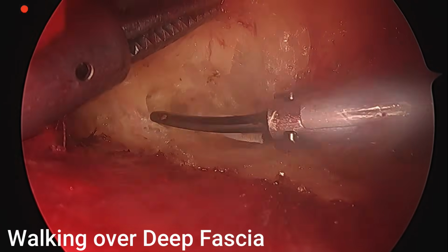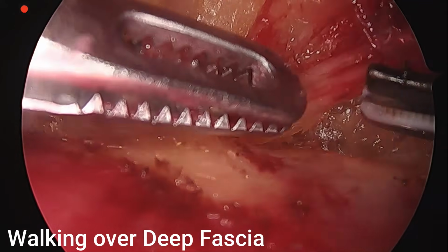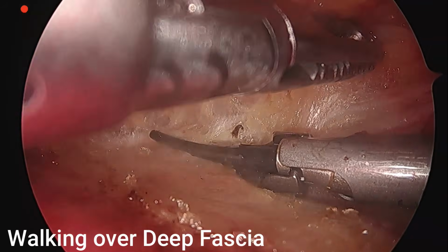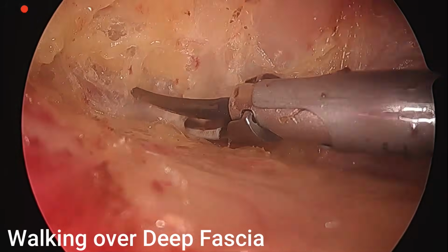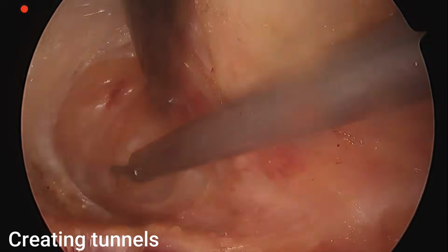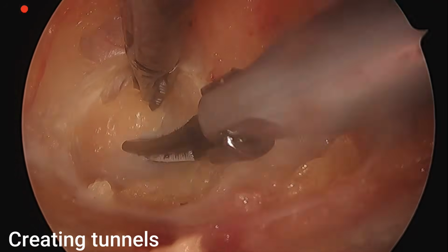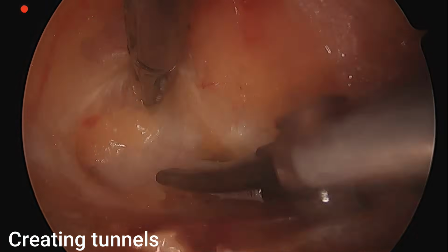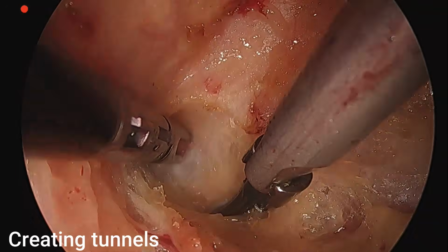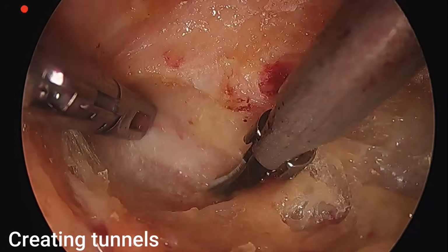The first step is working over the deep fascia. Now we can see we are walking along the deep fascia over the sartorius muscle laterally and adductor longus muscle medially. So this continues until we reach the inguinal ligament. This is called creating tunnels medially and laterally. You can see the glistening layer of the inguinal ligament laterally. Now this is on the medial side where we expose the inguinal ligament. So two tunnels are created.